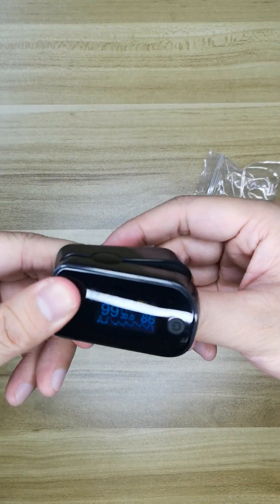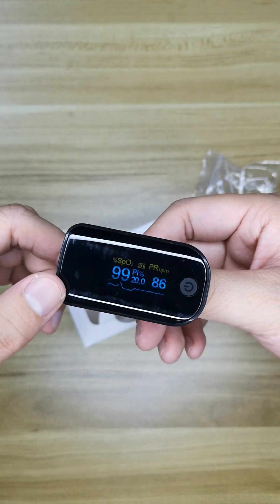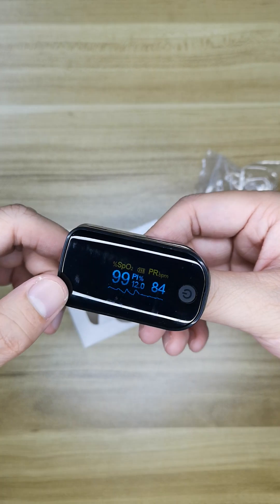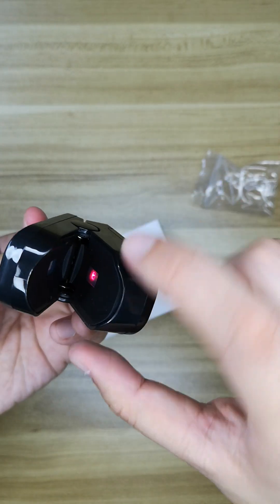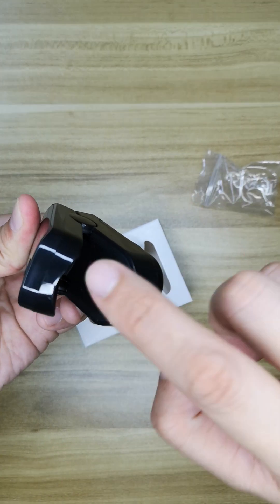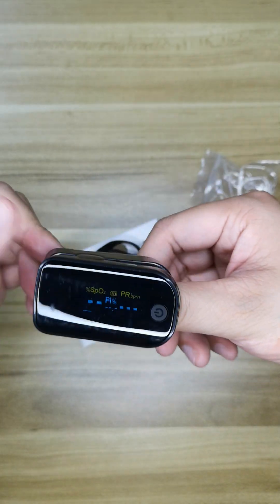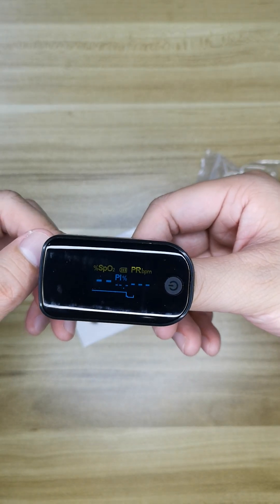We change to another finger. And you can see this is the sensor — it will keep monitoring your pulse.